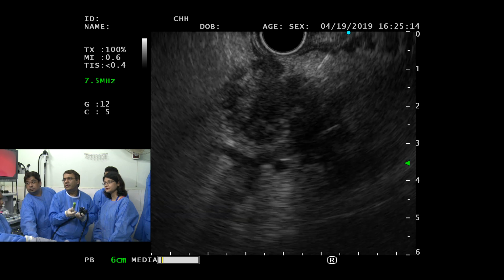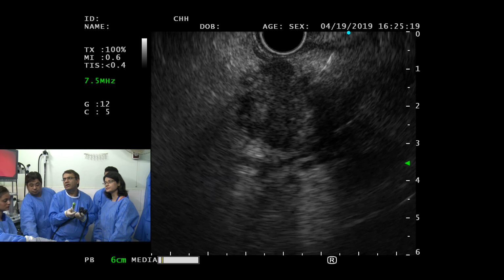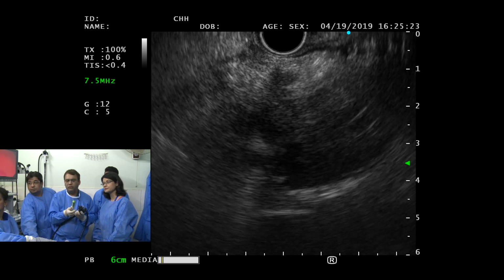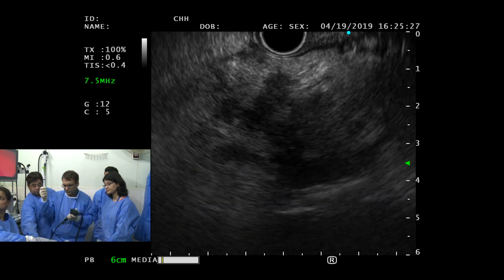The needle is visible very well, and see, I'm going only once in one place, okay? So I did 4, so I'll take it out and I'll give the needle to Wasim.